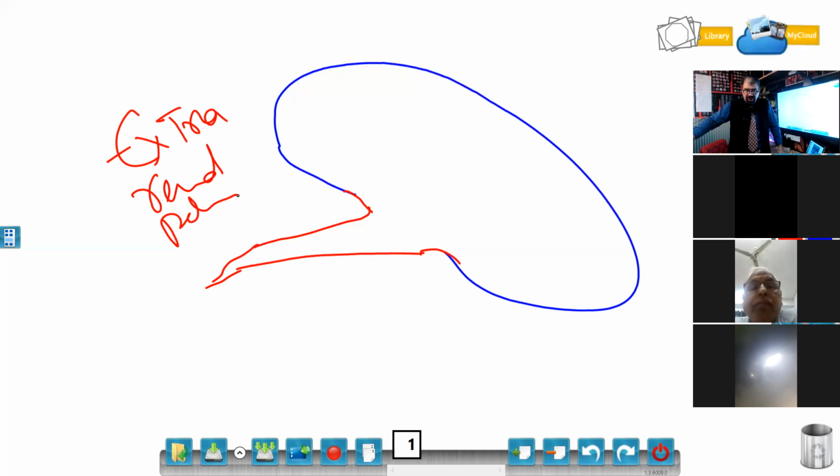Question: how to make a diagnosis of extrarenal pelvis and not a hydroureter? Because it will very easily look like a hydroureter.